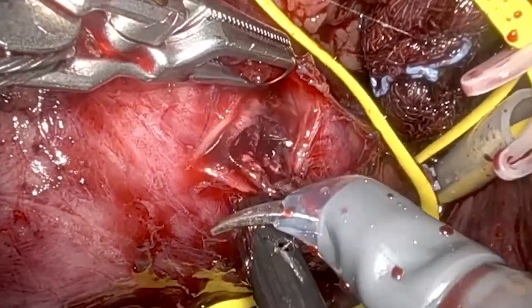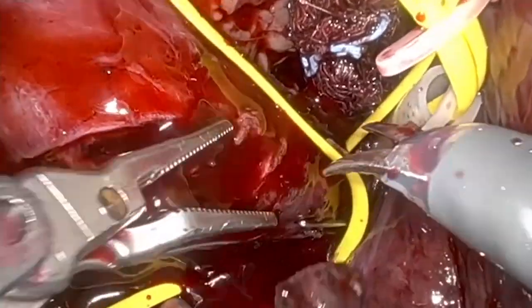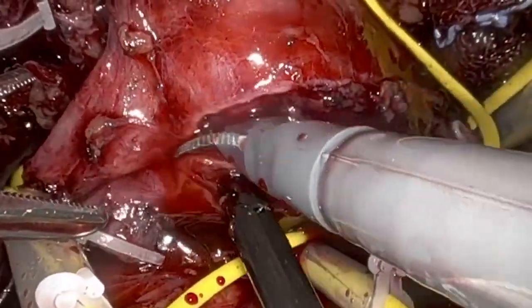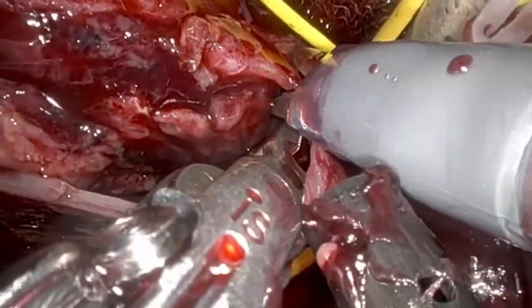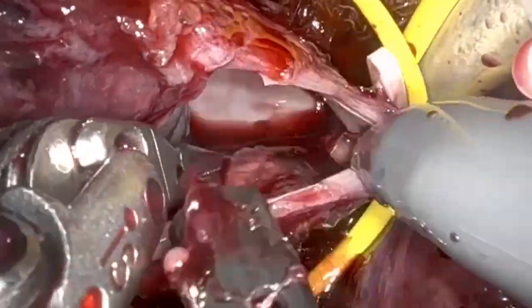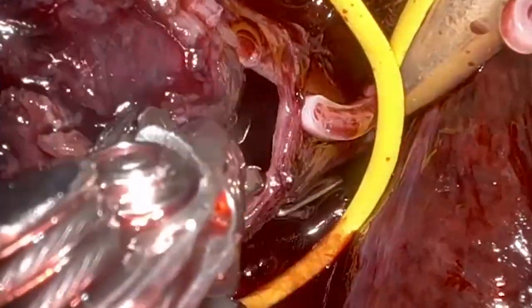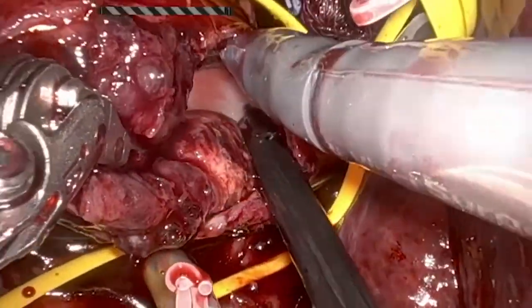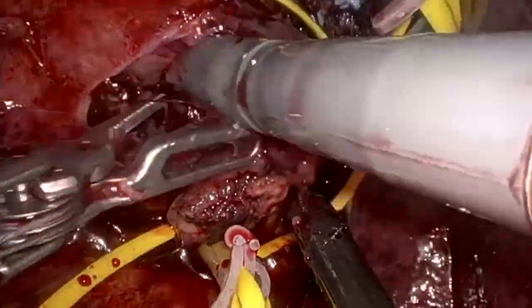We start the cavotomy in the anterior surface of the cava. We remove the tumor thrombus with en bloc extraction, and after this step we cut the posterior face of the renal vein and also perform early sectioning of the thrombus.